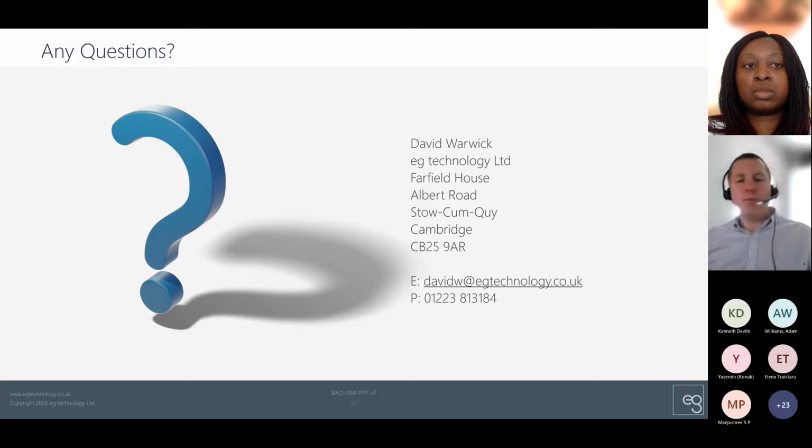I don't feel like that's really a very satisfactory answer, but there's probably an entire talk to be done on risk management. But if you identify the actual harms that can occur to the patient before you start delving into the risk management, that will hopefully keep you a little bit more grounded in terms of disappearing down the rabbit hole of doomsday scenarios.